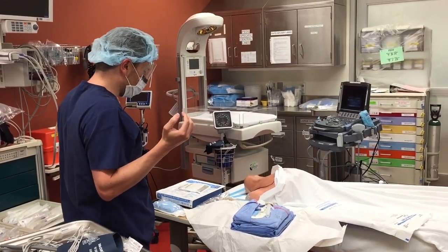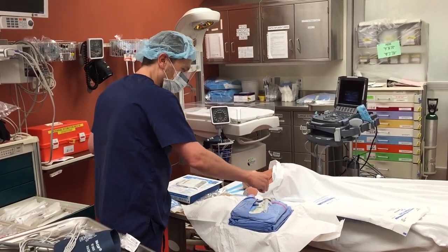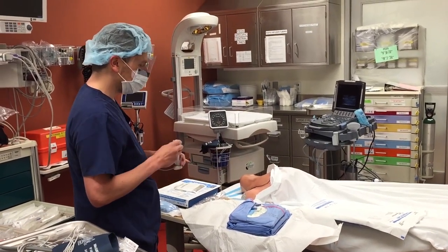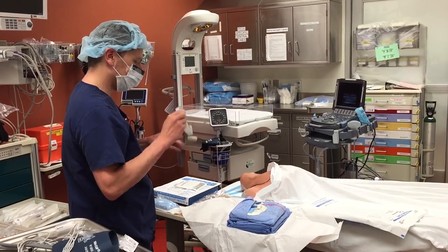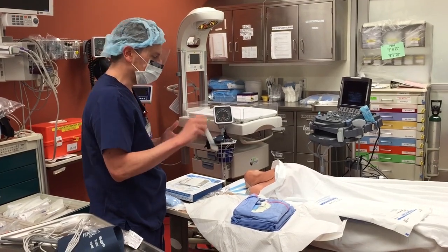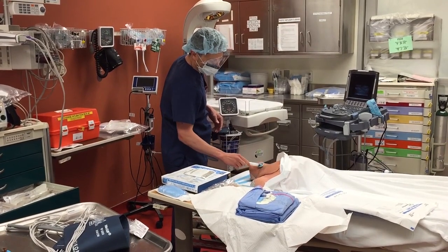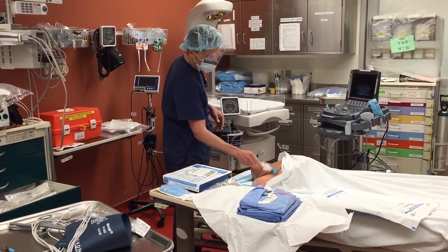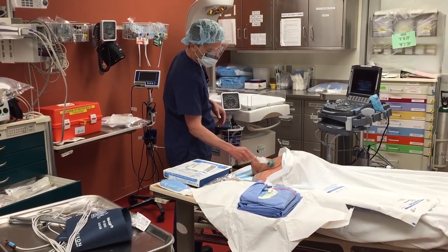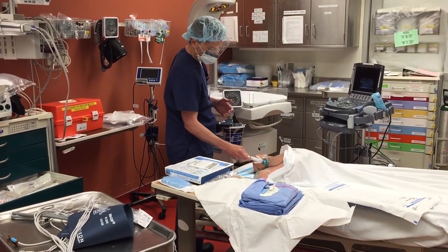Here's where the first real no-no for central line prep occurs, but we have to work with what we've got: I have to reach into the kit and grab this prep without touching anything else. Everyone in the room at this point should have a mask on if they're anywhere near the patient. We're going to prep wide — over our site, well into the lower part of the neck, as well as over the clavicle, so that if we had to do a subclavian, we would.